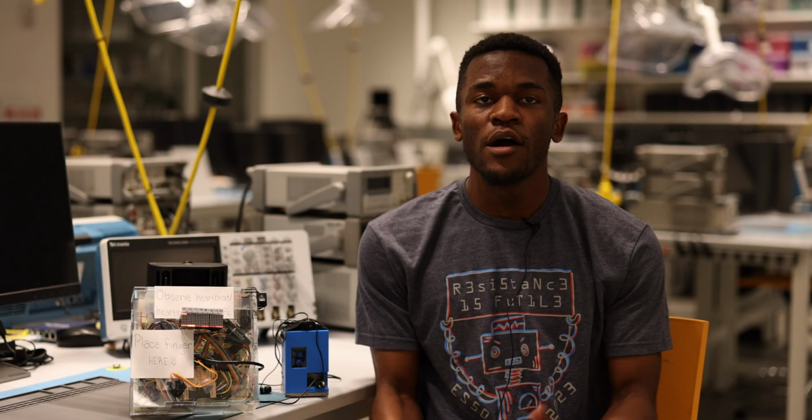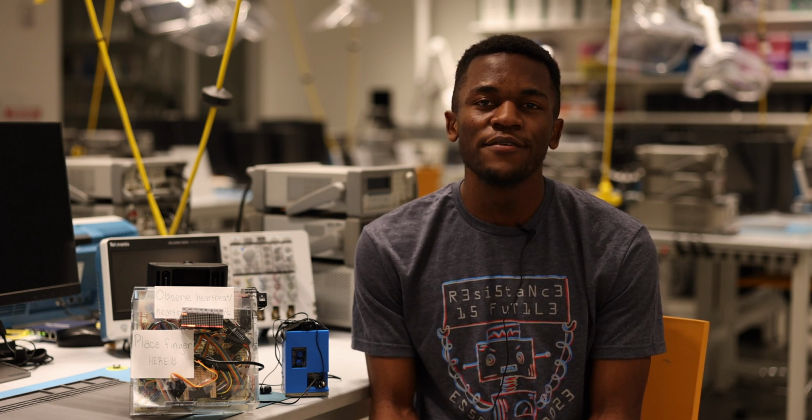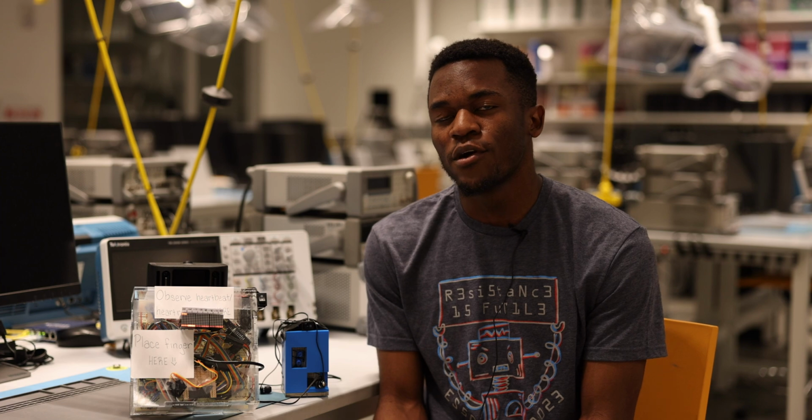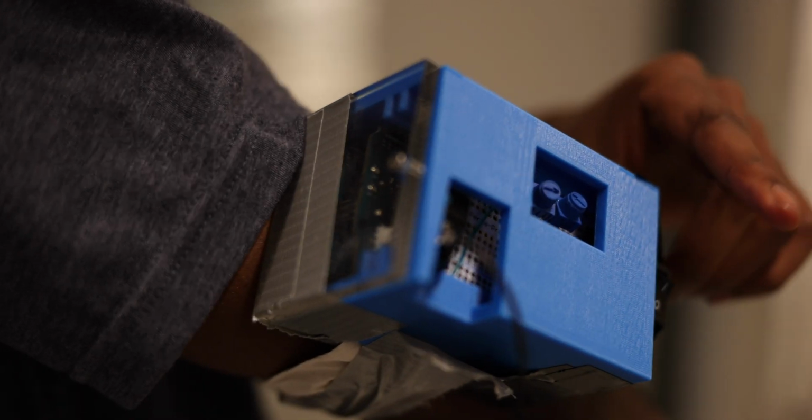Today, we shall uncover how optical heart rate monitors work and how smartwatches track cadence by creating devices using circuit elements taught in ES50. We made a heart rate monitor and a cadence monitor. How does it work? Let's start with the heart rate monitor.